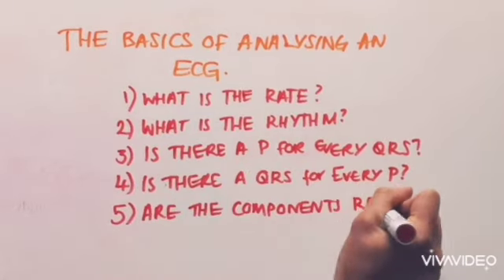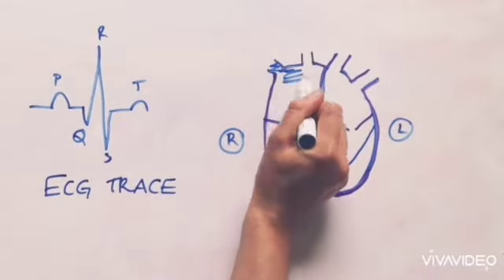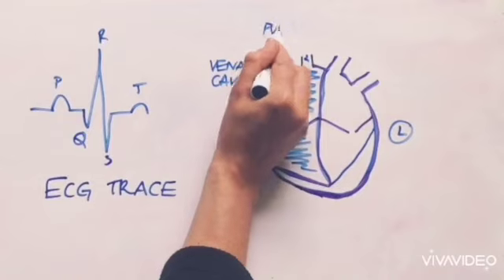I'm not going to go over very much of the basics of an ECG, so if you need to look this up, please go and look at another video first. Here I've just drawn a little ECG trace on the left, just to refresh your memory, and then a diagram of the heart on the right.